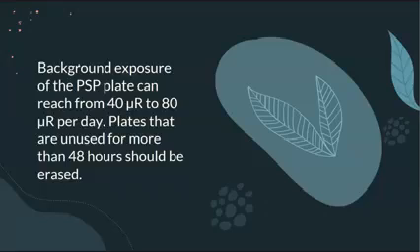Okay, here is an example of what happens if the cassette has been exposed. For letter A, image A was processed from a CR plate that was erased and then stored behind the control booth during an abdomen exposure. So, before siya na-expose to scatter radiation because of the abdomen exposure, it has been erased, which is proper practice. Okay.